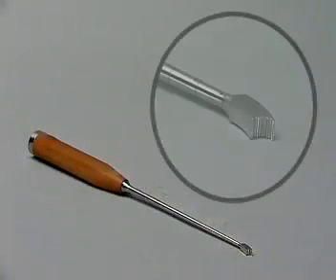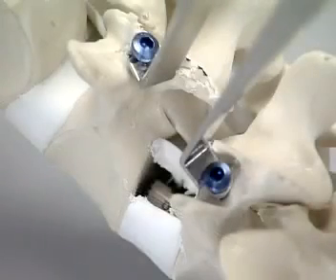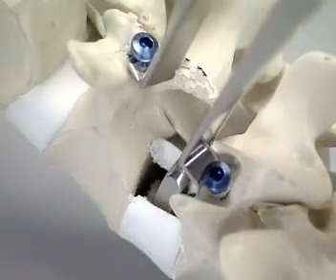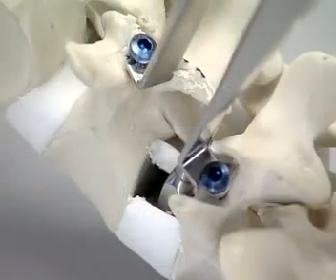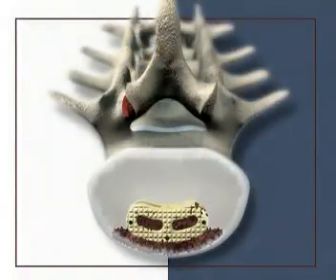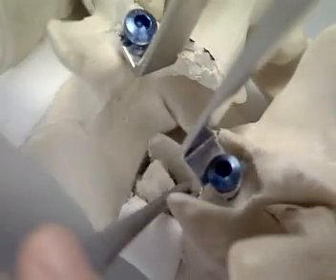After ensuring the cage is held correctly, it is inserted into the intervertebral disc; slight taps on the implant holder may be necessary. The implant holder is removed, and an impactor is used to adjust the cage to its correct position. The cage is ideally placed in the anterior half of the vertebral body end plates, with the anterior rim six to eight millimeters posterior to the anterior edges of the adjacent vertebral bodies. Using the image intensifier, the AP position of the cage is verified. The posterior disc space is then filled with additional bone graft material or bone substitute.